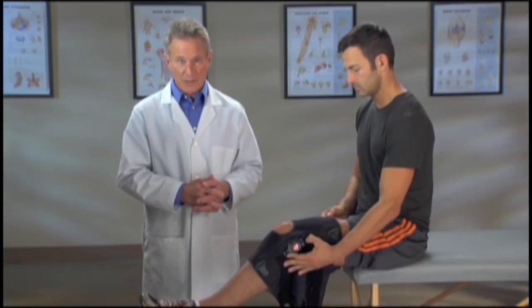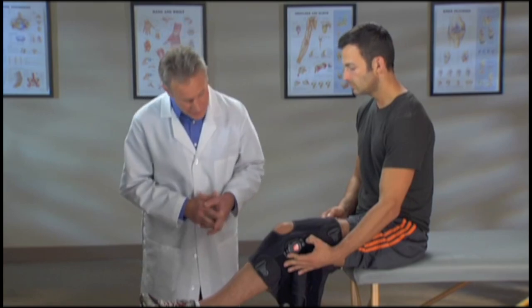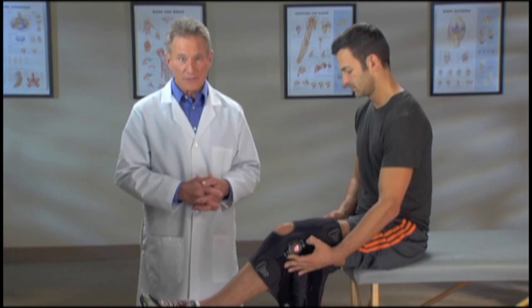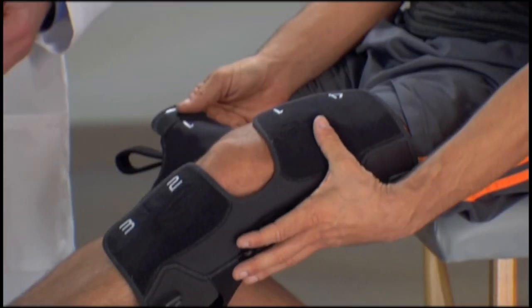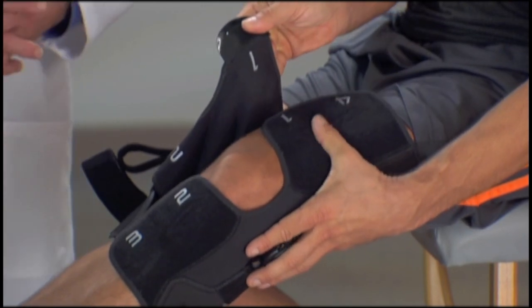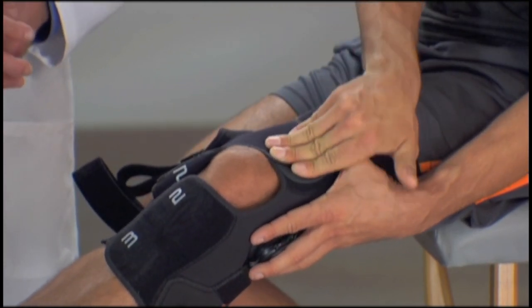Now we'll go through the strapping sequence. As you can see, the straps are numbered, making it easy to follow the correct order. Hold the brace with one hand, use the other hand to pull tab number one across the thigh above the knee, and fasten it securely.